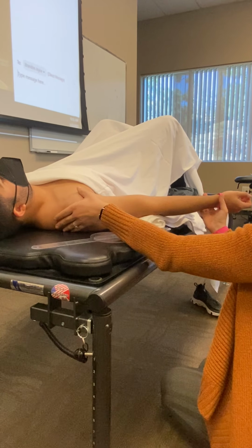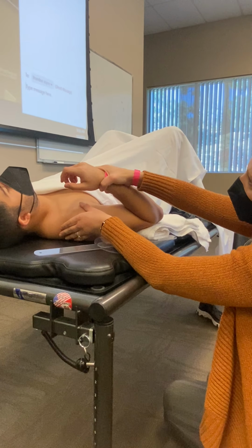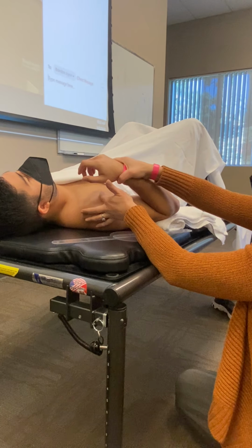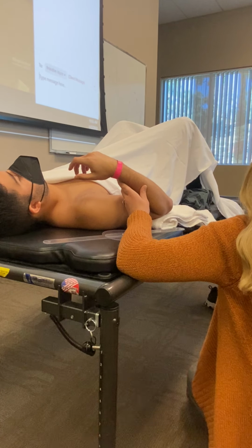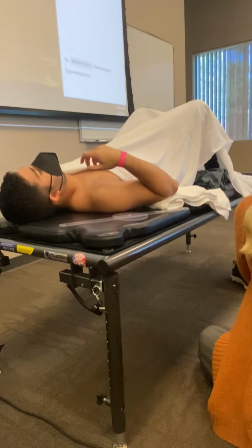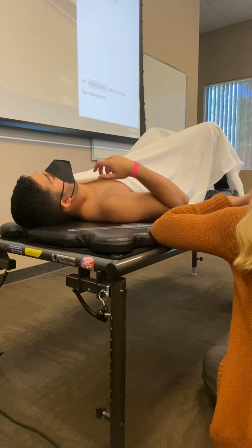So also in the same position, bringing him back. What kind of end feel would this be? Soft. Why is it soft? Because it's tissue. Sometimes if you get a very slender person, whether they're elderly or just slender, you might get more of a firm end feel, so you're going to get some more of those ligaments resisting before you start hitting soft tissue. If you get a bulkier person with a lot of soft tissue, you might get a super squishy soft tissue end feel much sooner than you should. But yes, it's usually a soft end feel for elbow flexion.